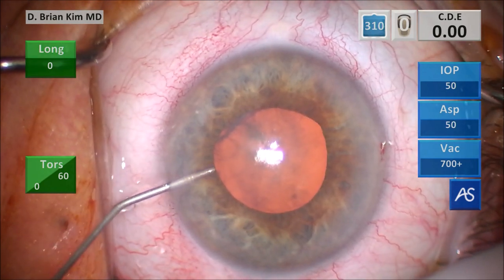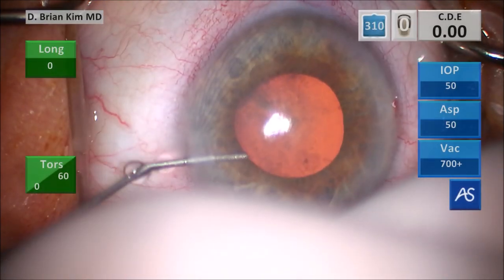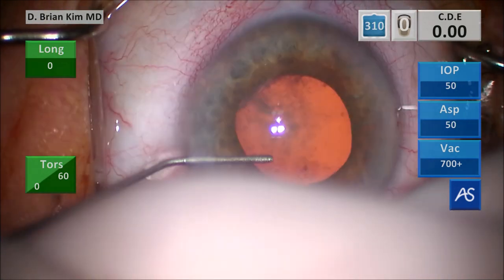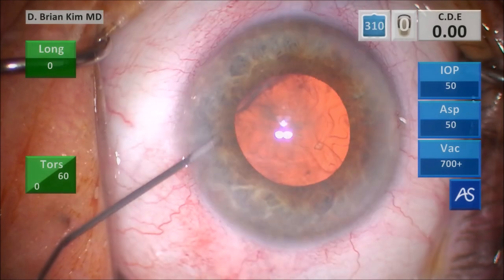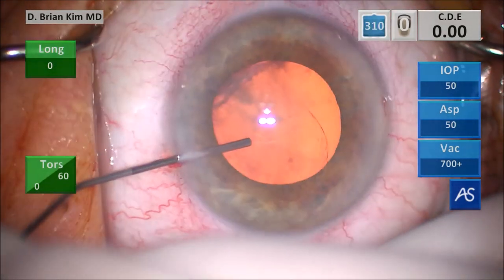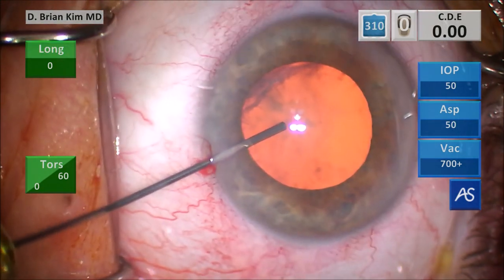This is intracameral lidocaine and then some intracameral epinephrine. You can see this pupil is a little bit on the medium size, so I'm going to use a little epinephrine to help me. And then this is some dispersive viscoelastic to dilate the pupil, fill the chamber, and coat the corneal endothelium.